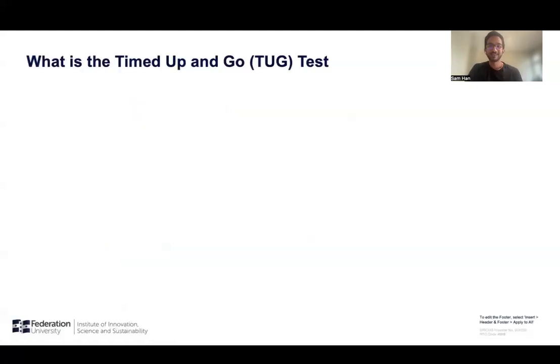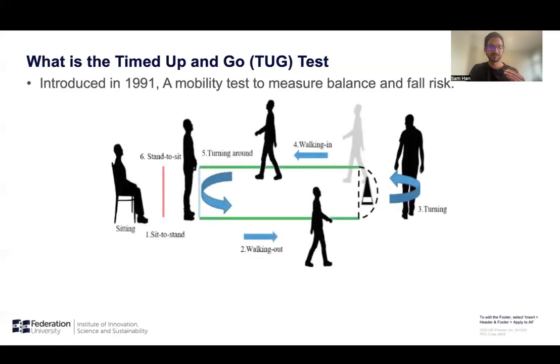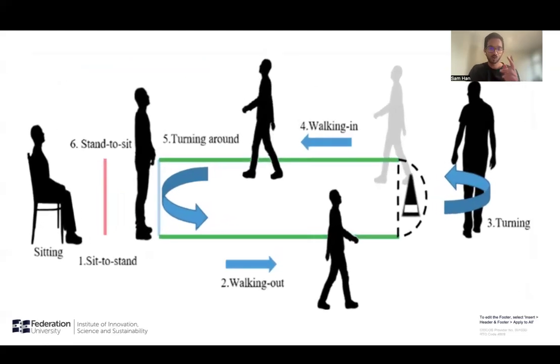So having that in mind, the best gait analysis technique to predict risks of falls is the timed up and go test. It is an observer-biased test which is done mainly in lab settings. A patient comes and sits on a chair. At the word go, they stand up, walk 3 meters, turn around, come back 3 meters, turn around and sit back on the chair.